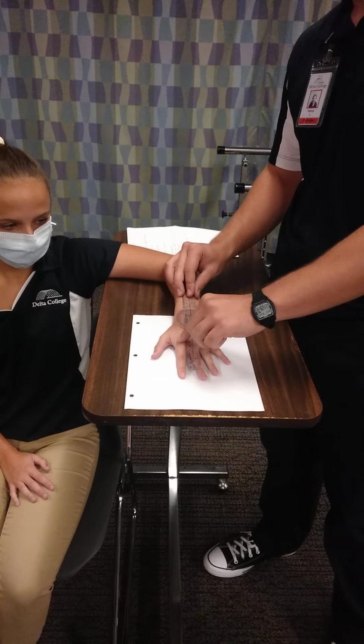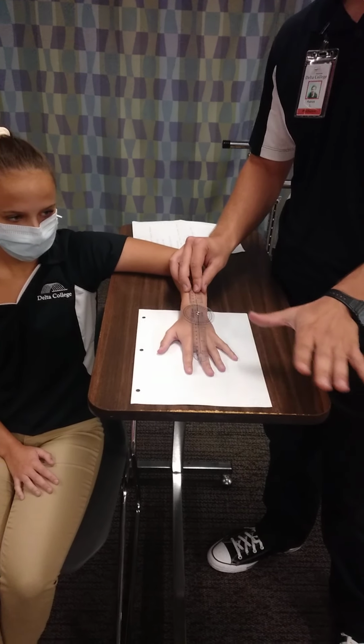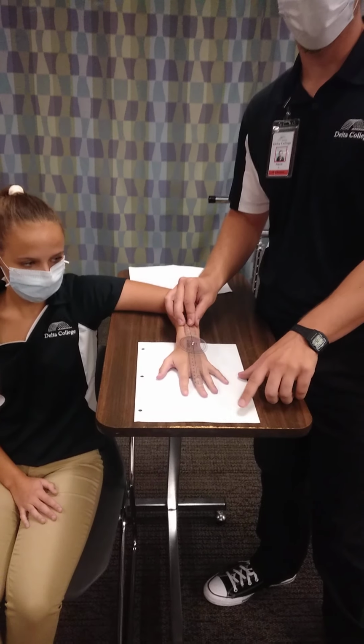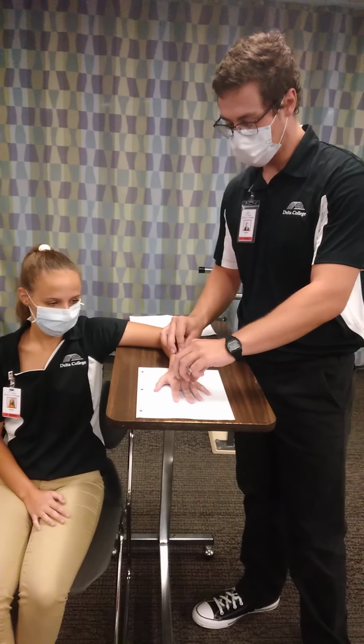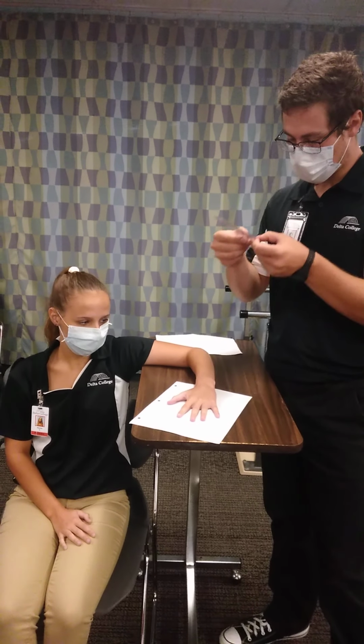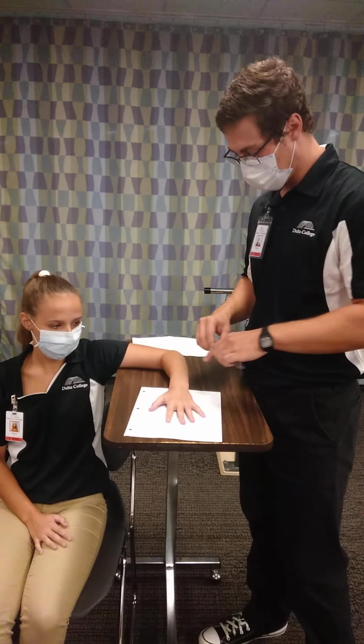follow that third metacarpal. So what you'll have your patient do is turn their wrist towards them, and I have this piece of paper underneath their hand to reduce some friction. So when you're ready. And she got about 25, which is in the normative value.